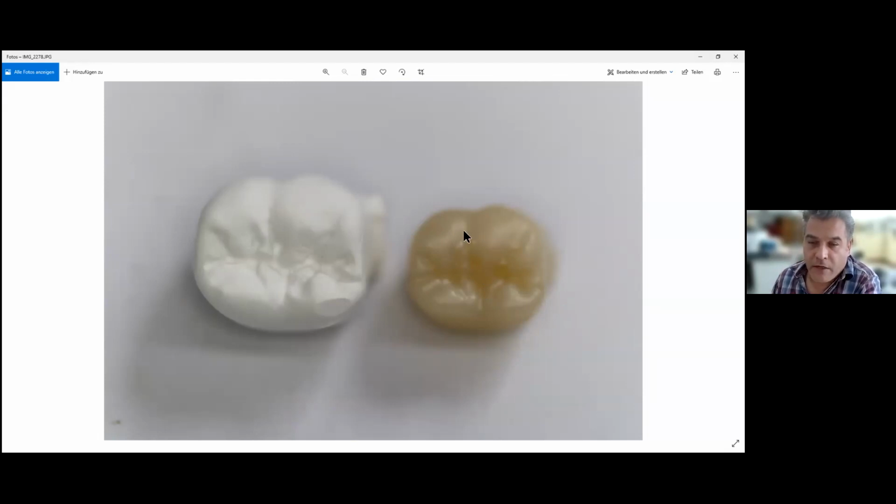You put your stains and your glaze, check occlusion and your proximal contacts. You can imagine how much time you will save on this case, compared to layering some porcelain. For anterior cases, normally we add a bit of porcelain because it's more aesthetic.